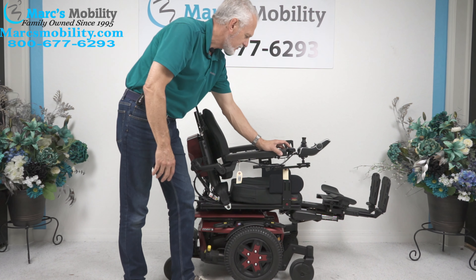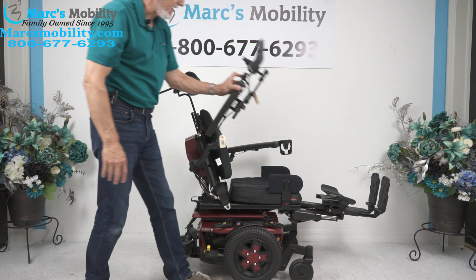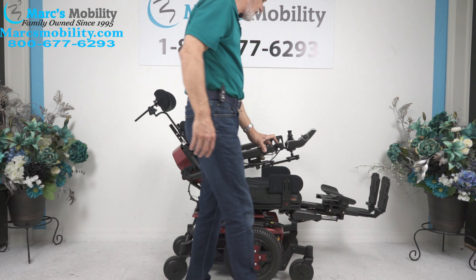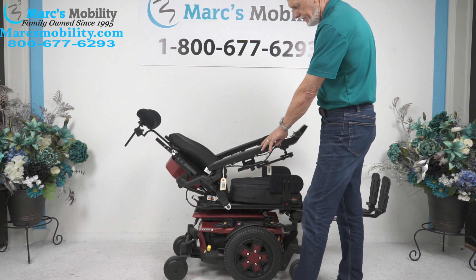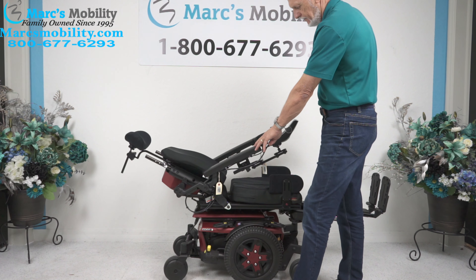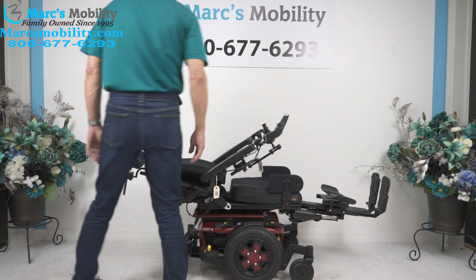The next feature on our chair is called the electric recline. The electric recline is the back going back by itself — so this is the back going back. That's the electric recline right there. If you were laying flat, that's what you'd be looking at.